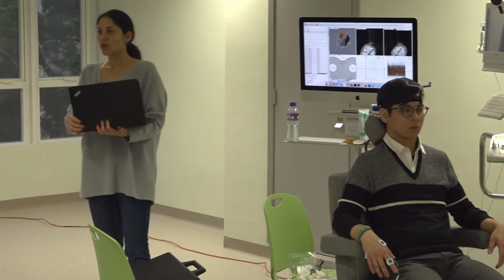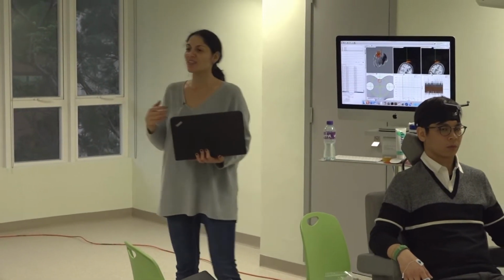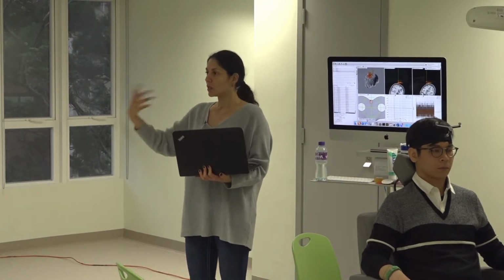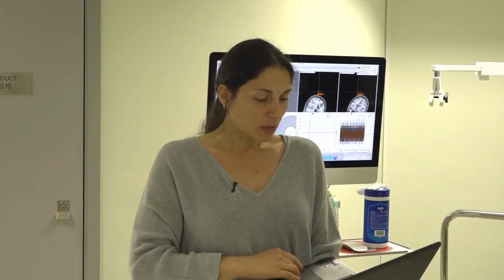And now that I'm thinking and I'm doing it on my own, I think the PES is nicer in this. I don't like it so much sometimes because it calculates along with an algorithm, the value, and sometimes I feel that it gets married with a certain value, you know? So I'll explain what it means.